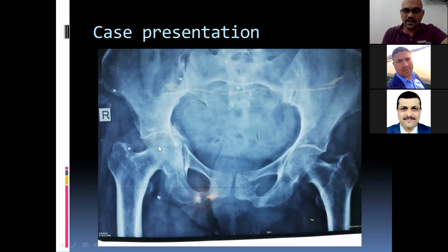Well, this is an acute fracture, my dear. There is no advanced osteoarthritis, but you can see that the head of the femur is medialized, and you can see this line from the lesser trochanter of the right side. This is the line where there is a significant shortening due to a centrally dislocated hip, right? Yes. Okay, thank you very much.